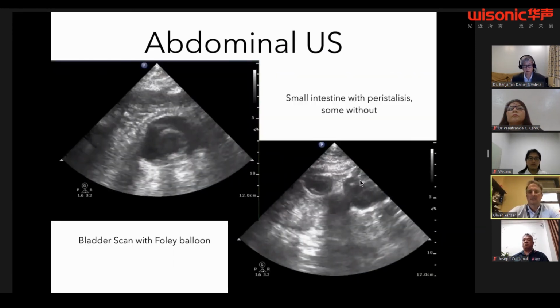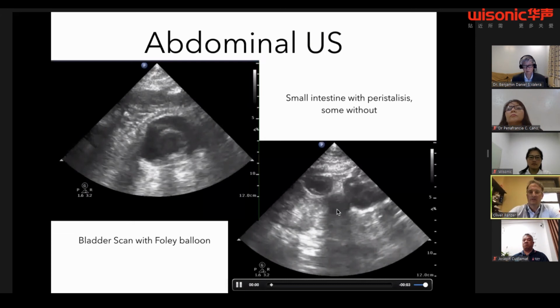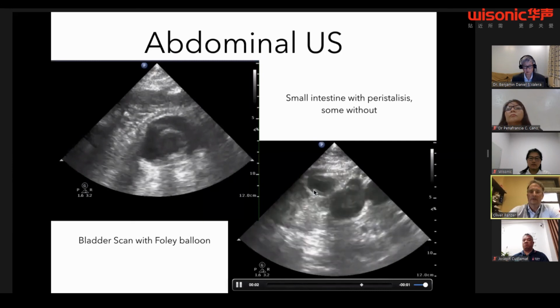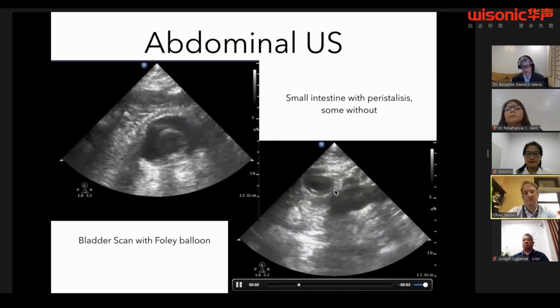We expanded this because of the abdominal X-ray, and this is just an incidental finding that I found very interesting. You see here small bowel loops on the right lower image. You see two. One that's clearly moving has good peristalsis, for a small bowel actually quite a bit of peristalsis. And you can see another piece of small bowel that actually looks thickened and does not move at all. That raises the suspicion for a pathological process like ischemia.